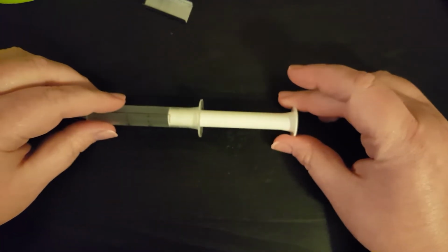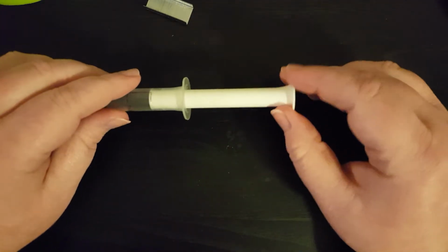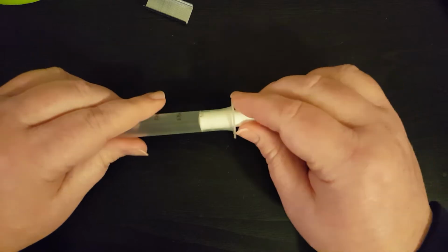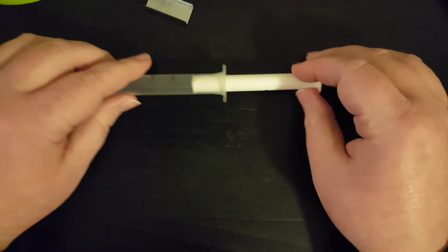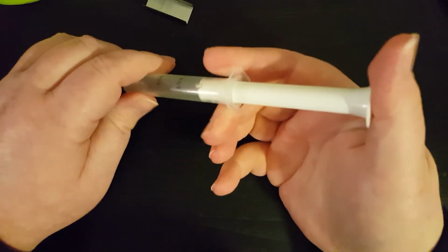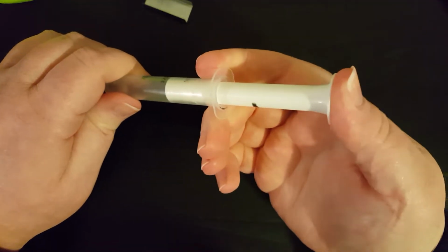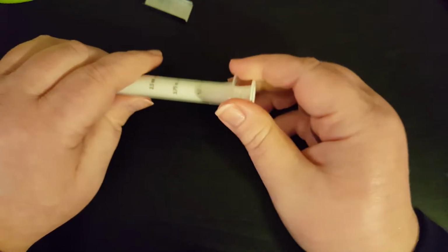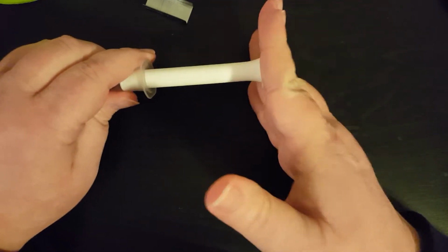So we have our syringe, and to make this as descriptive as possible, I'm going to talk a little bit about what the syringe looks like and give you the names of a few of the pieces. Where the medicine is, in the tube area where the liquid goes, that's the barrel of a syringe. And then the back, where you push to remove liquid, is the plunger. At the back of the plunger is a flat area, that's the very end of your syringe.